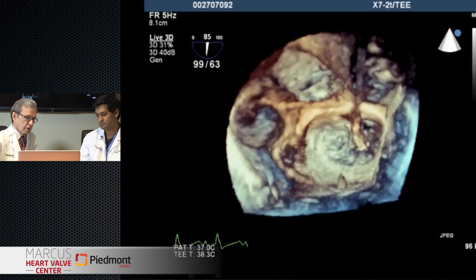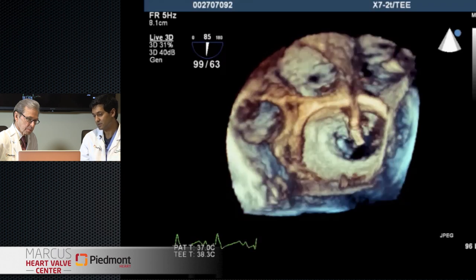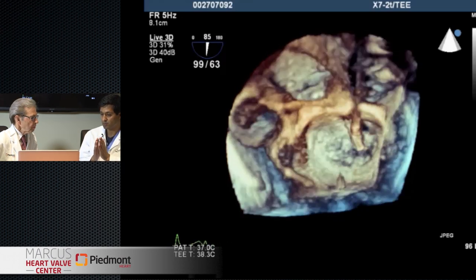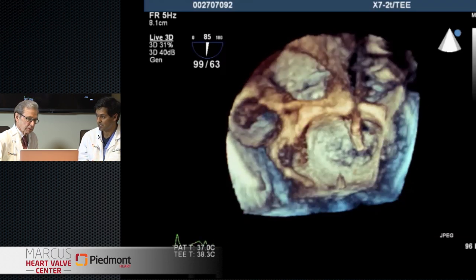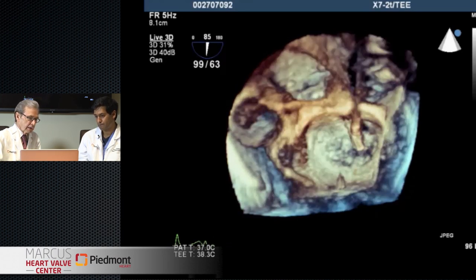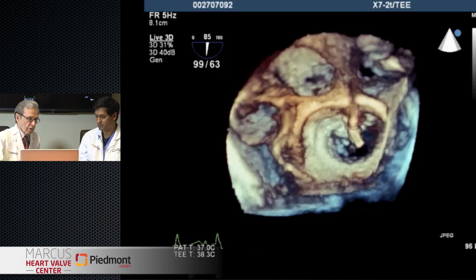This is the 3D-TEE view - the so-called surgeon's view where we're looking down into the left ventricle, as if we're in the left atrium looking down. This is a very helpful view for orienting the arms. When we open the clip, we want these arms to be perpendicular to the line of coaptation of the valve. Depending on where you are, the angle can change, and 3D is really helpful in allowing us to align those arms with the valve. It looks like you're lined up between A2 and P2/P3. It's a reasonable position to start - we can do some fine tuning, but it's a good start.